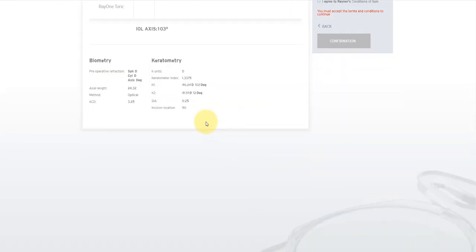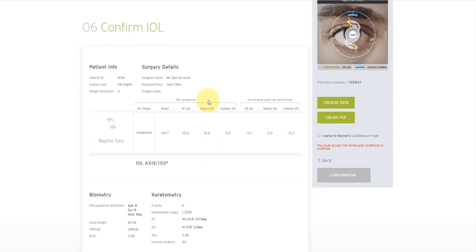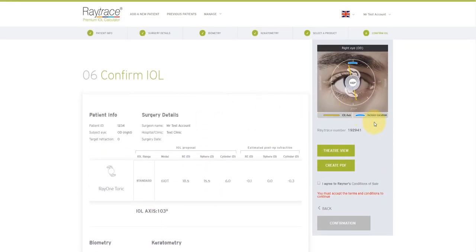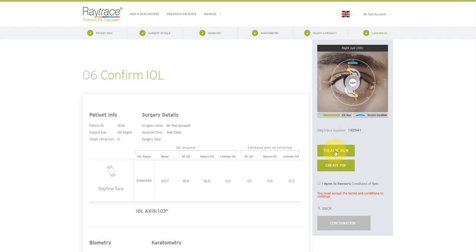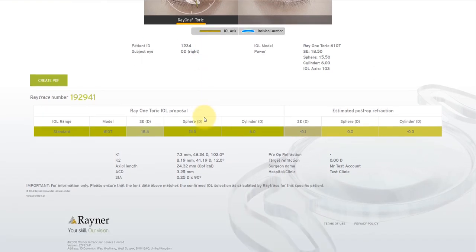On the final Raytrace screen, a unique Raytrace reference number is available to you here on the right hand side, and it's essential for tracking and monitoring your IOL order should it progress. You can create a PDF or you can enter theater view. Theater view is a really useful and printable landscape page for use in the operating room.